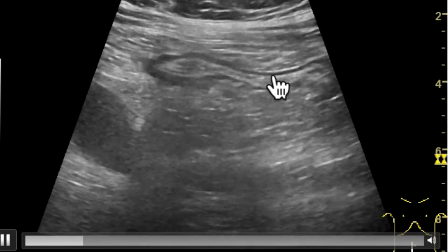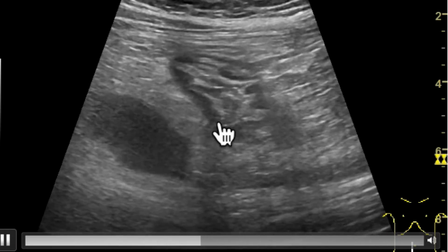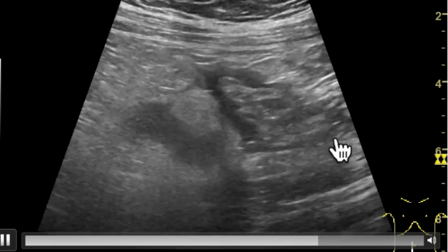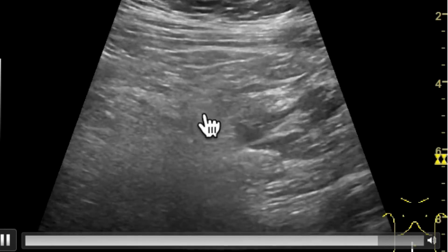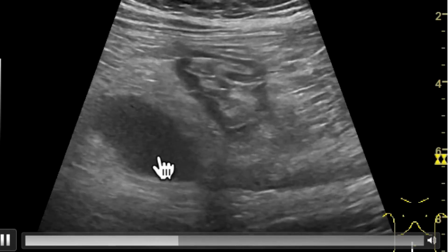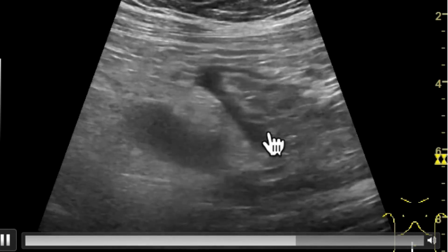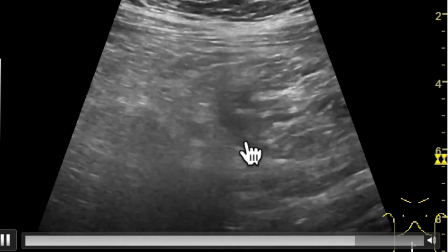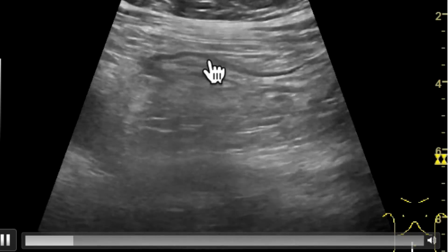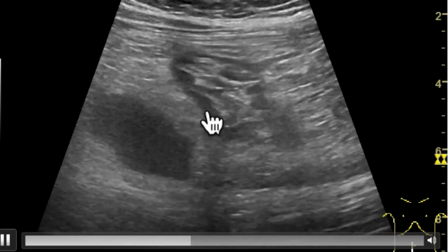Here again, a section of normal colon wall. Then, starting here, the thickened colon wall and the surrounding reticular reaction. And in this reticular reaction, there is the echo-free formation. This is the sigmoid colon. The sigmoid colon is somewhat thickened and, not atypical in adults, it runs in a loop from left to right. It does not always have to be in the left lower abdomen. Often it makes a small loop and also lies on the right.